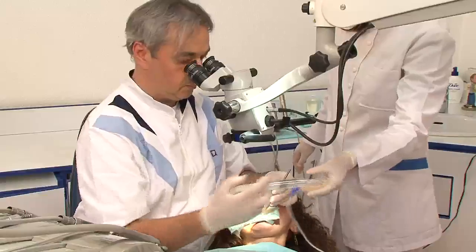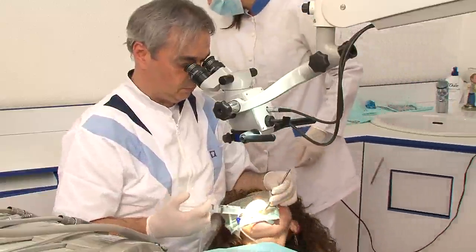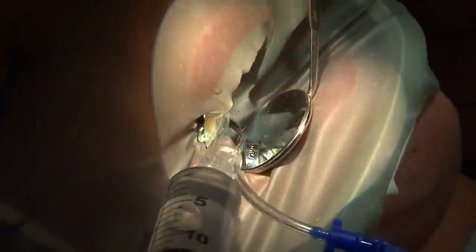After the patency check, all debris are taken out with the INDOVAC. The tip of the INDOVAC must be angulated towards the access cavity.